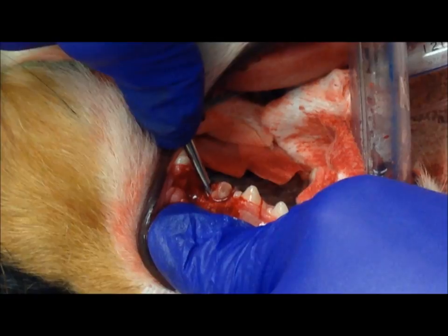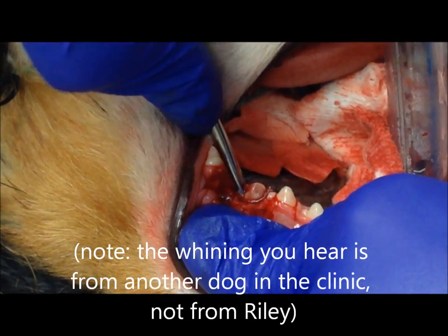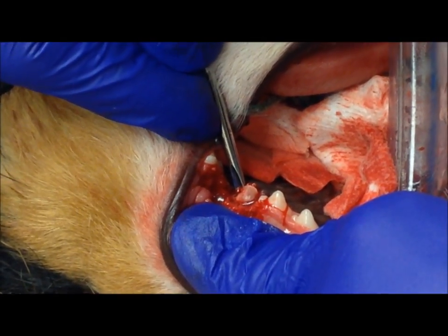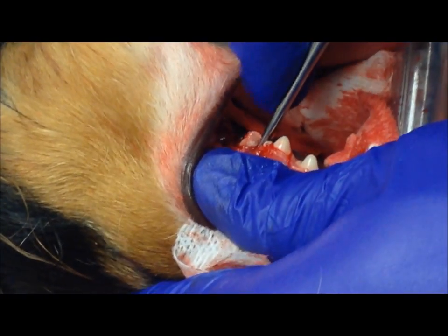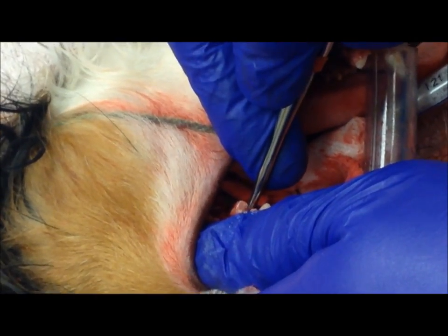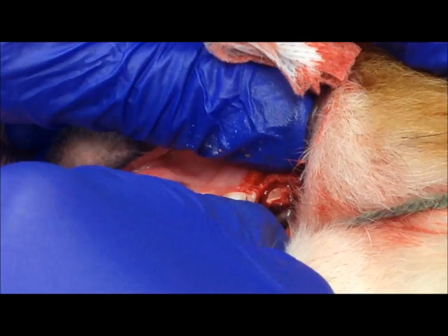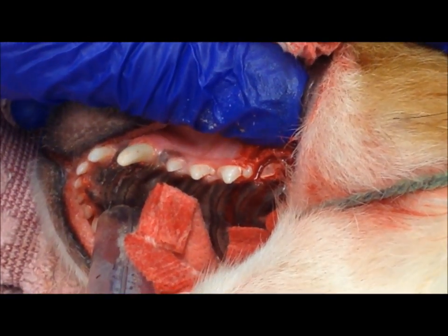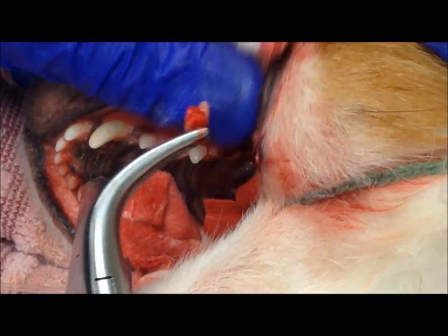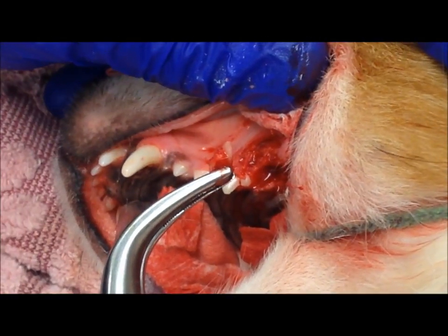Now we're gently luxating the third root, or the mesial palatal root. I've got it luxated. Let's see how tight it is in the socket still — gentle twist, there we go. There's some attached tissue but you can see the tip of the root is intact, so it's been completely excised.